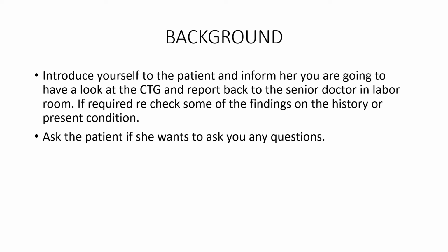Along with the background check, always introduce yourself to the patient and inform her how you are going to have a look at the CTG and you are going to report back to the senior doctor in the labor room. If required, recheck some of the findings on the history or the present condition. Ask the patient if she wants to ask you any questions. This is part of the counseling and the introduction that you would do for any patient.